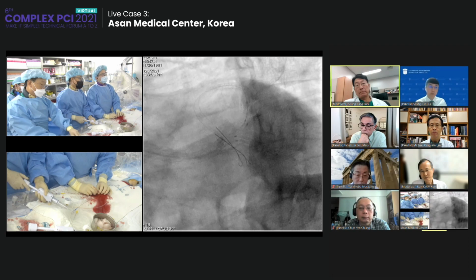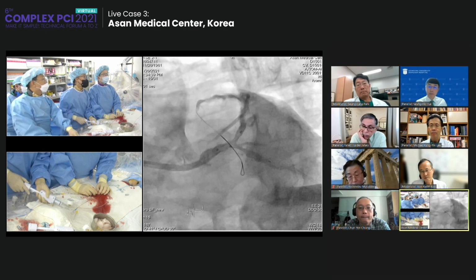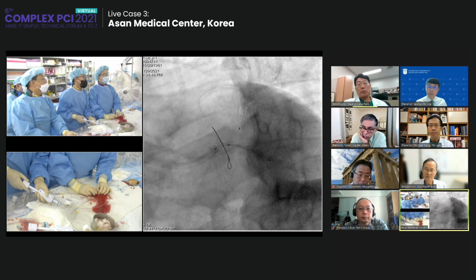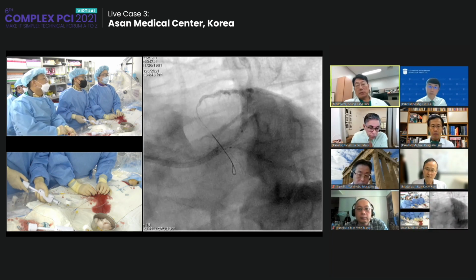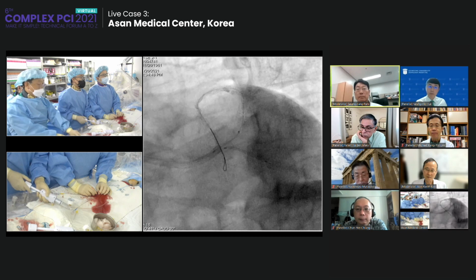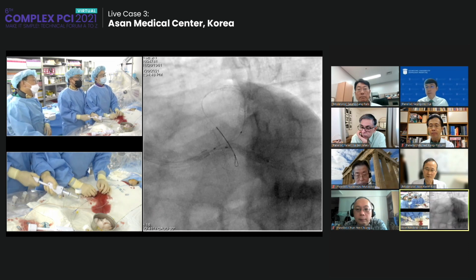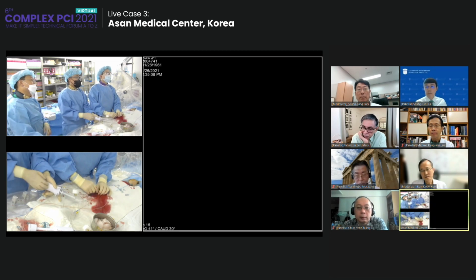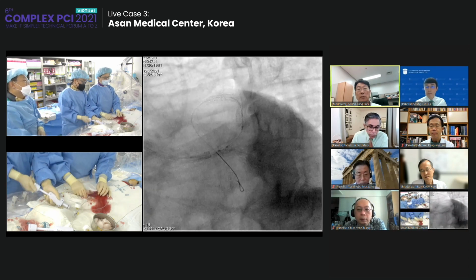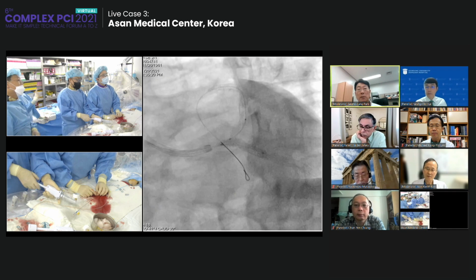Good. Okay. You need to come back a little bit. A little bit more. Pull the stent 0.5 millimeters, something. Okay, a little bit more. Okay, good. Yes, 12. This is 3.5. 12. Okay, 16. Small part, okay. Still some indentation over there. 18. 18. Great. It works.